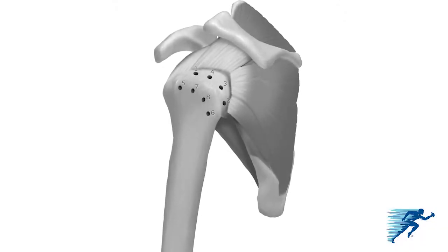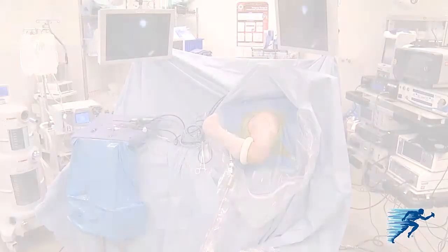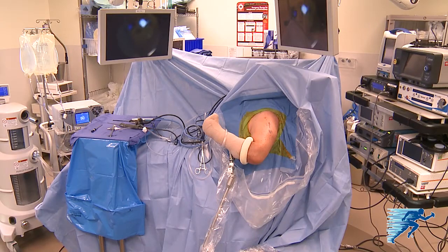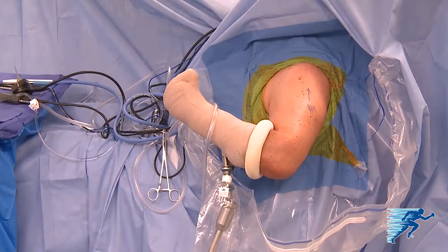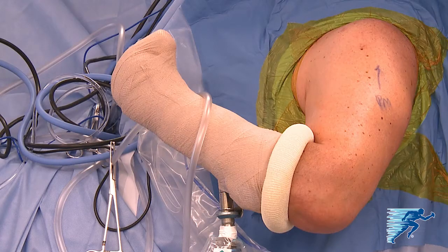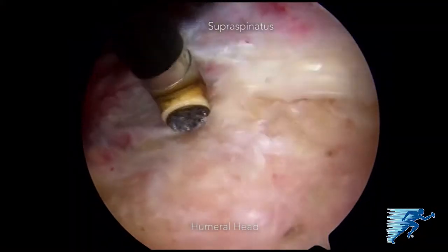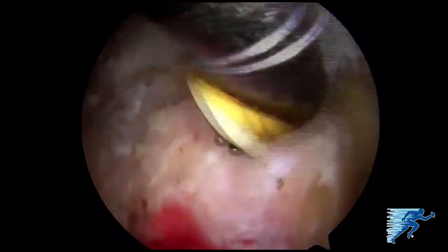We'll show an example using eight anchors — four medially and four laterally — to repair this tear. The arthroscopic surgery is performed under general anesthesia with an additional interscalene catheter as needed. The patient is placed in the modified beach chair position with a pneumatic arm holder. Standard posterior and anterior superior portals are created and diagnostic arthroscopy is performed.